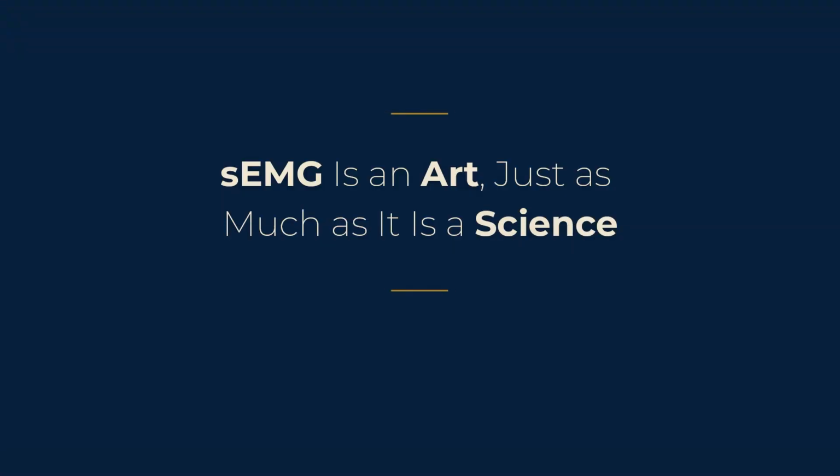Number 3, sEMG is an art just as much as it is a science. It's not a perfected process, but it is a very helpful piece of the big picture that is being supported more and more in the literature. One important thing to know about sEMG is how the signal may be impacted differently from patient to patient. The signal has to travel through layers of muscle, vasculature, fat, skin, and sometimes facial hair before it gets to the surface where your electrodes can detect it. And we know that body composition is different for each patient, which can impact the signal.